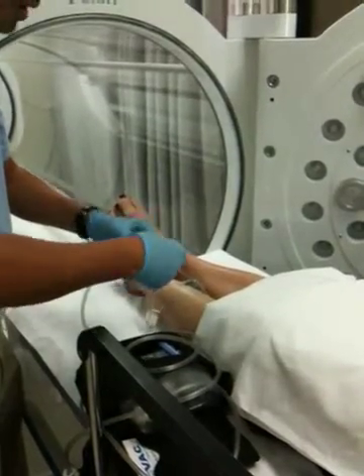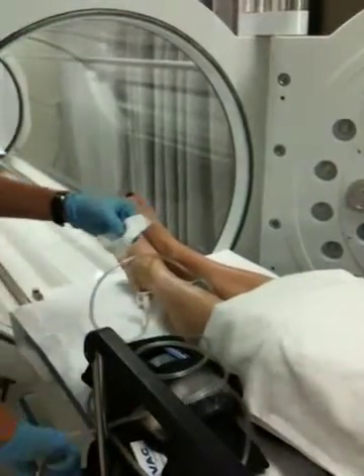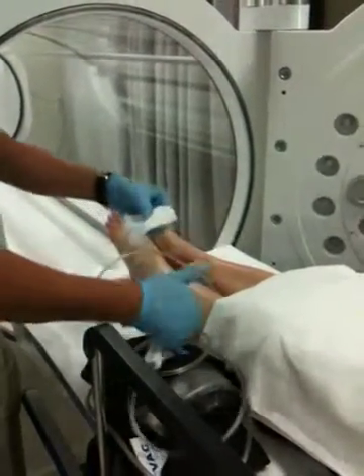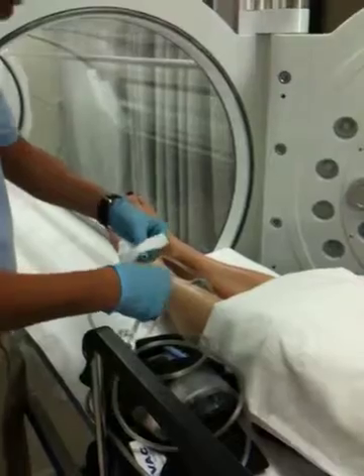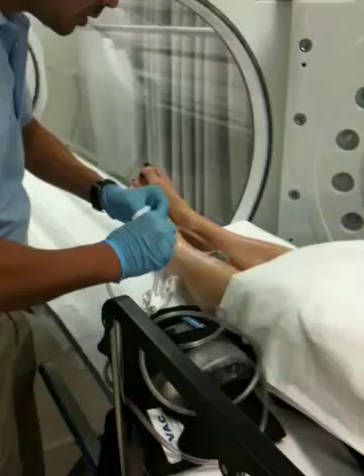Always watch out when you're reconnecting the other side that you don't flick this part in your eyes so you don't get the exudate. Try to handle it carefully.